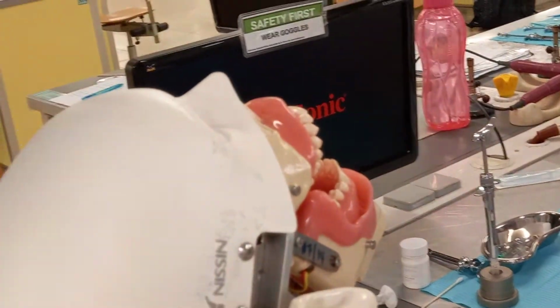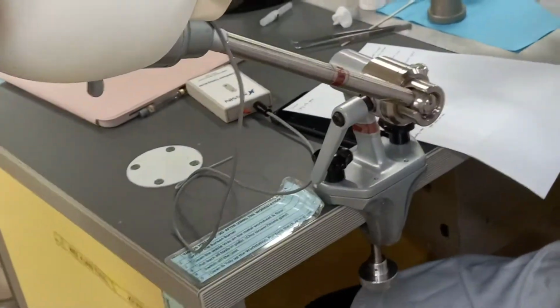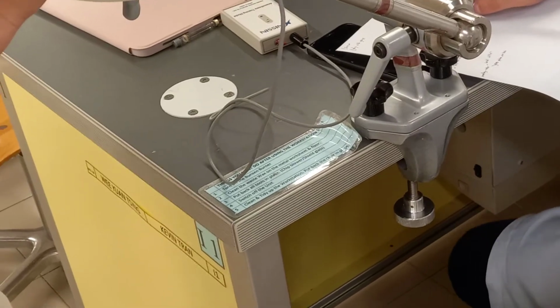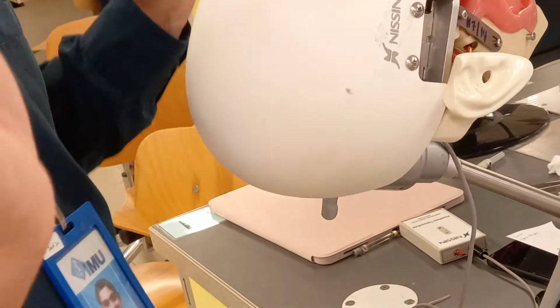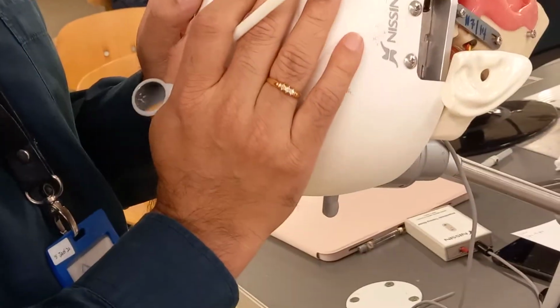So that's why your depth of penetration is very important. See in the X-ray how long the root is. If it's a child patient, you don't have to go so much, just a bit, because most of the deciduous tooth roots are resorbed. So try. If we ask you to give anesthesia for the extraction of a premolar tooth or whichever tooth, you have to give both. If you give one side and sit, the examiner won't say anything, but you will lose half the marks, because you cannot extract.